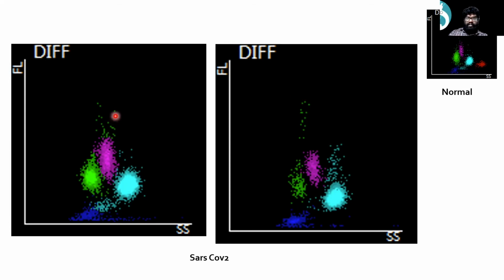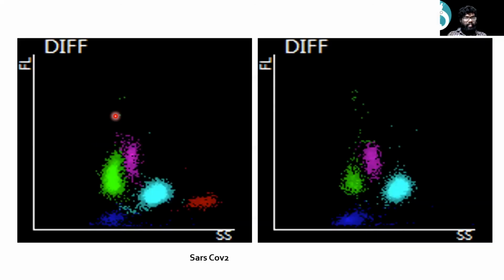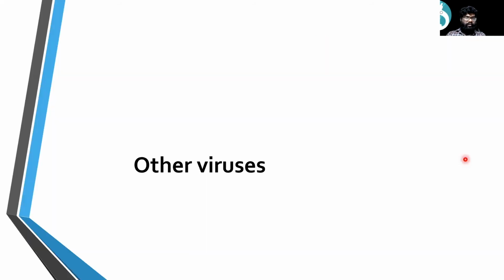When we looked at the morphology of these cells, they looked more like plasmacytoid-like cells, not vacuolated. The cytoplasmic membrane was smoother, not undulated like an atypical lymphocyte, which is characteristically seen in other viral infections. This is another case which also produces the same pattern of initially a scanty amount of high fluorescent cells, in almost the same numbers, except that the width distribution distances in these scattergrams vary, with widening of the gaps noted. Basically, all SARS-CoV-2 cases also produce lymphopenia during the course of the illness.